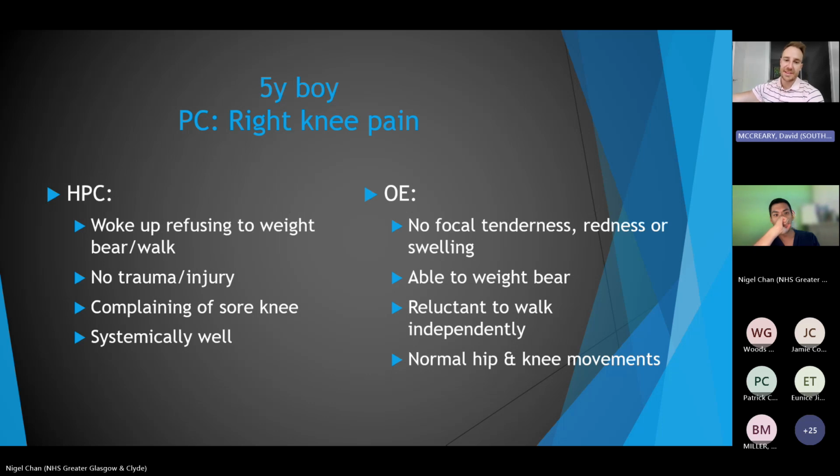We've replicated this study, which is going to be published in November. It's been accepted, it's just awaiting copy editing now. We did it with 140-something patients, and again we made up our own clinical decision rule, very similar, ages 1 to 10, all of the other same features. And how much accuracy could we apply that clinical decision rule with? We didn't miss any septic arthritis, and we could apply it in 93% of cases.